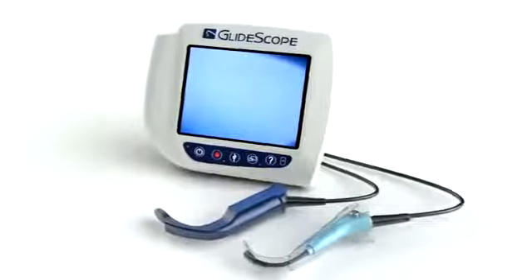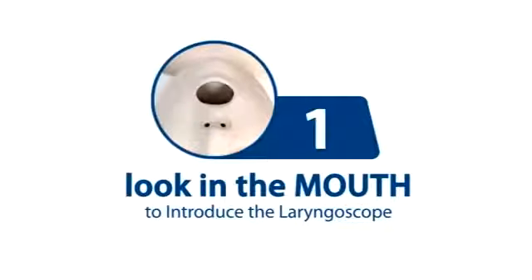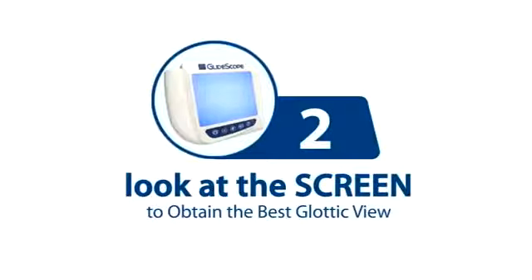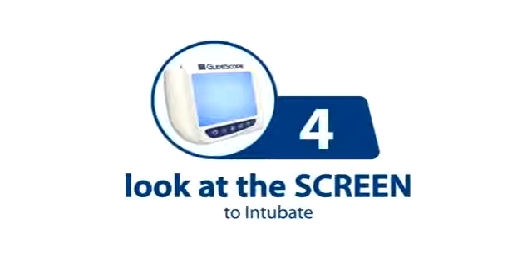Let's review the basic steps. Begin by preparing the endotracheal tube so it mirrors the unique blade angulation of the GlideScope video laryngoscope. Look in the mouth to introduce the laryngoscope. At the screen to obtain the best glottic view. In the mouth to introduce the endotracheal tube. And at the screen to intubate.